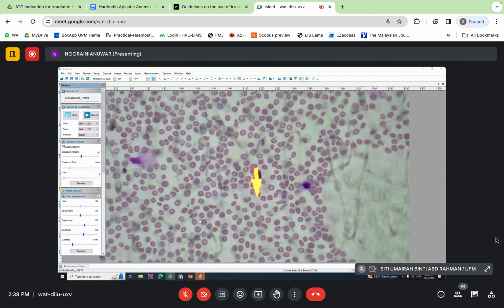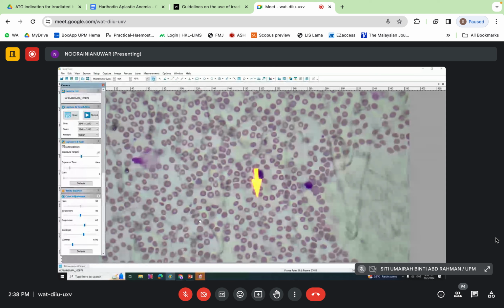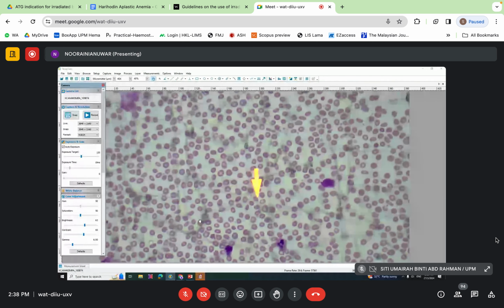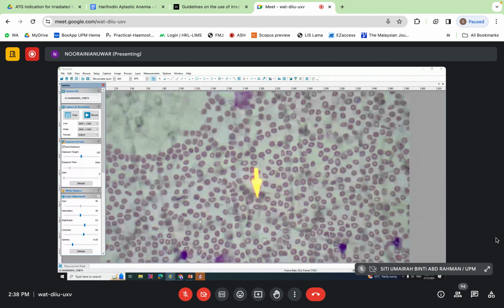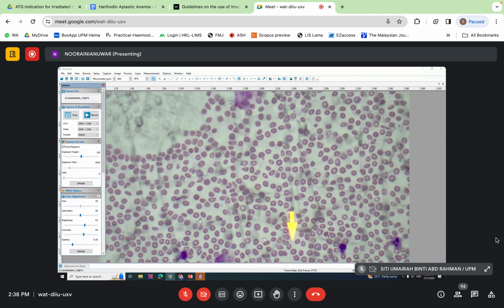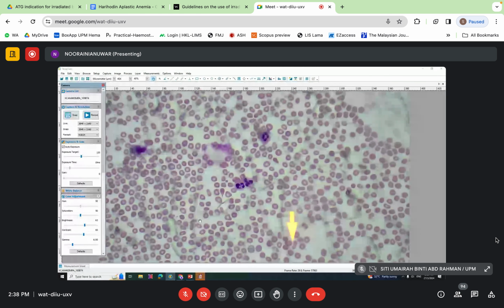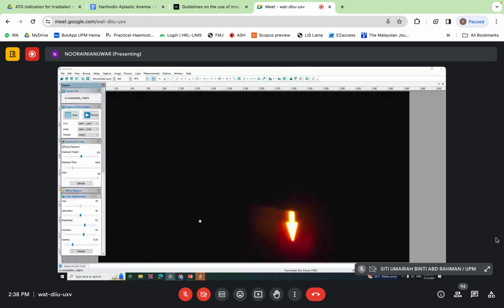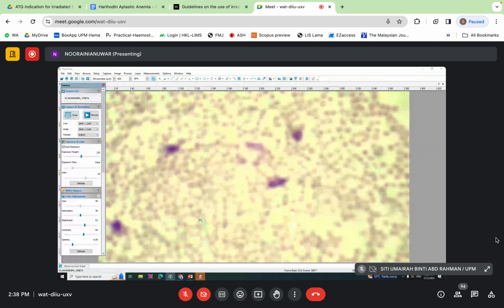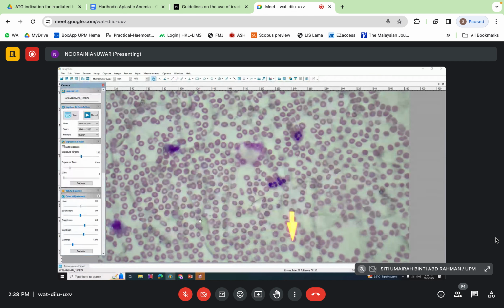There is no leukoerythroblastic picture. The microscope picture is not adjusted. Another three mature-looking lymphocytes here. A lot of artifact. I don't know whether your microscope has been serviced. The glue. Oh, I see. Okay, sorry for that.